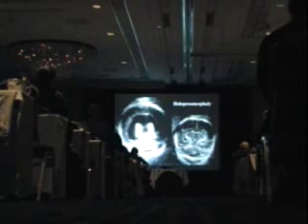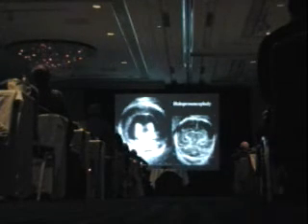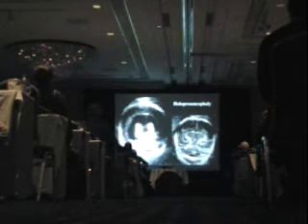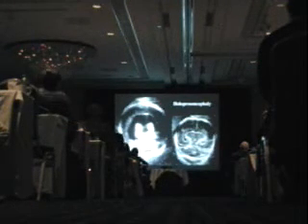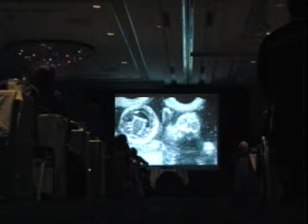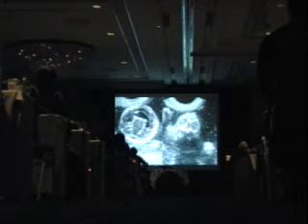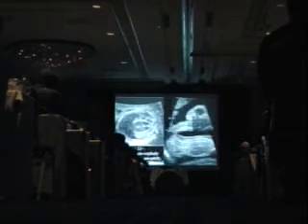Okay, the last area to go into is holoprosencephaly. This is a devastating brain abnormality, at least the alobar holoprosencephaly. You have an absence of the falx, so you have the central monoventricle. You have fused thalami with absence of the third ventricle, and obviously a very severe abnormality. They are invariably associated with severe facial abnormalities as well. They can have hypotelorism, eyes very close together. They can have terrible facial clefts. You can see how these thalami are fused into one without any third ventricle in between.